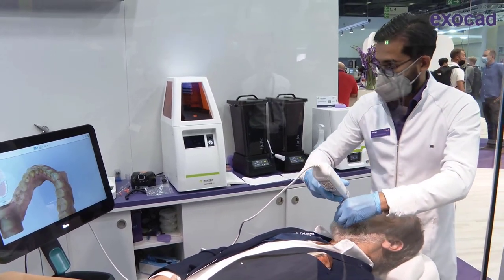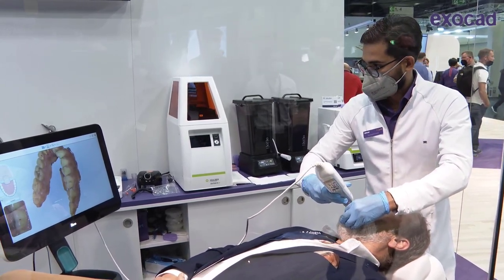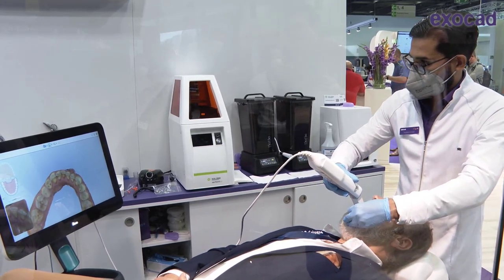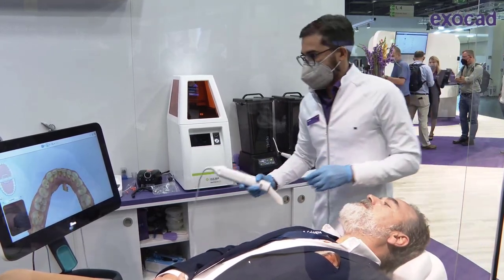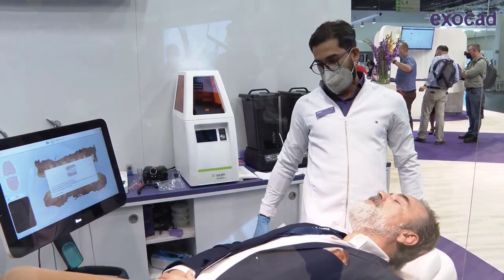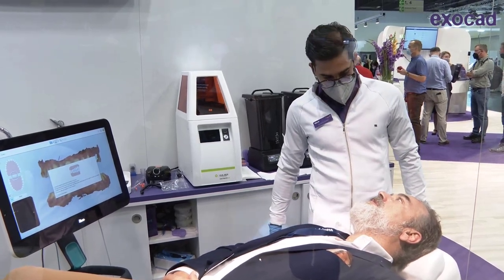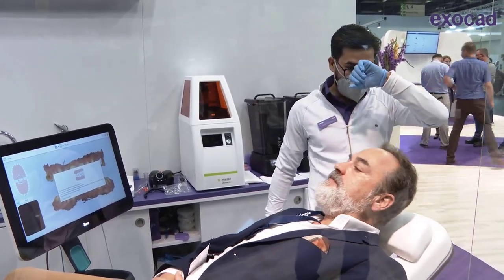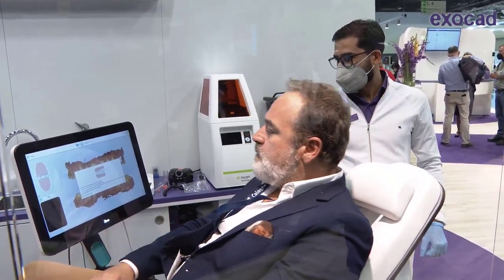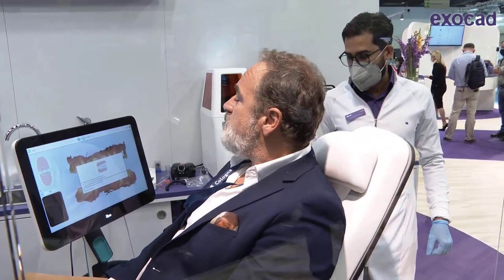All soft tissue — lip, tongue, fingers that land in front of the lens — will be automatically removed by AI. In case you need more gingival coverage, you can easily disable this feature to get all the way down a couple of centimeters if needed. The last step: we're seating the patient up to take a precise bite scan.